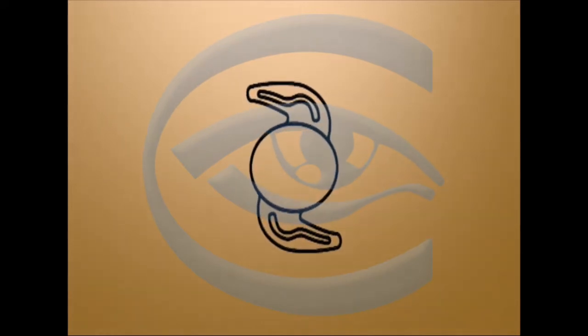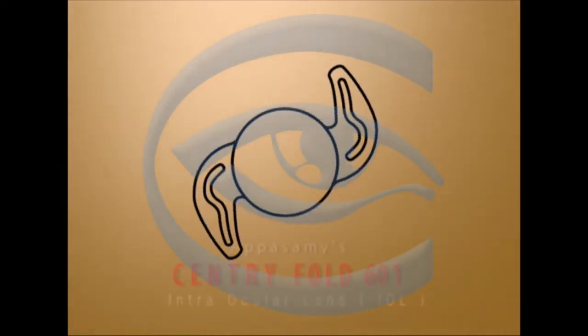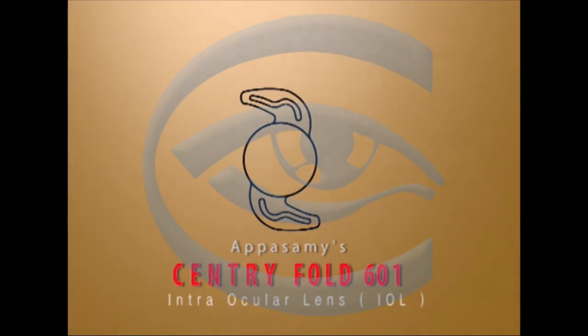Instructional video for the implantation of Appasami's Centrifold model 601. This is a hydrophilic acrylic foldable intraocular lens from the Acrifold series.